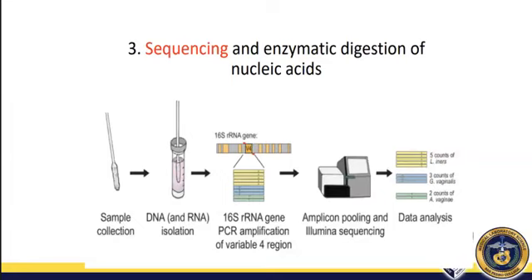Okay? So, for more information on selecting the appropriate database pag nag-sequencing kayo, you can always refer to the Clinical and Laboratory Standards Institute or yung sa CLSI na MM18 document. Okay? So the MM18 document contains the interpretative criteria for identification of bacteria and fungi by targeted DNA sequencing. Meron silang ganun. So again, CLSI document MM18. So to choose the specific type of sequencing and the specific type of target gene, okay, for sequencing.